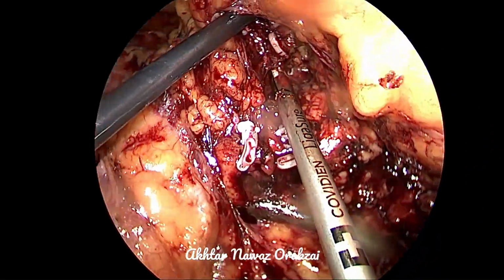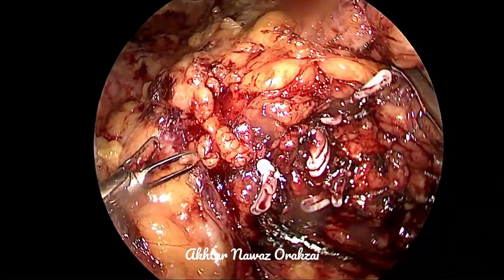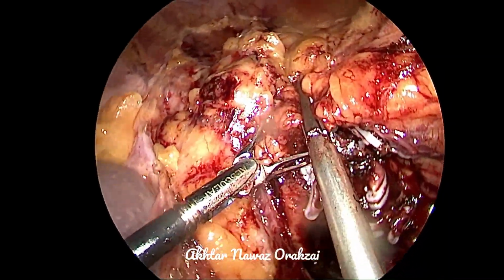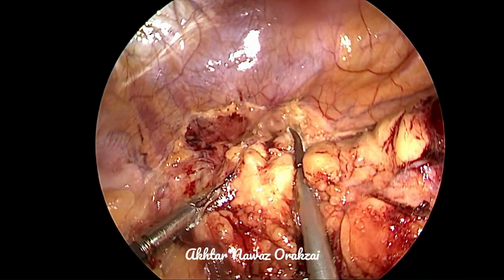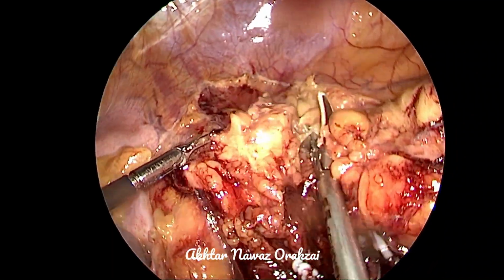So the artery is almost complete now. Same goes for the adrenal gland, the upper pole and the adrenal gland. Horizontal dissection. The rest of the procedure is the same as described in other videos.